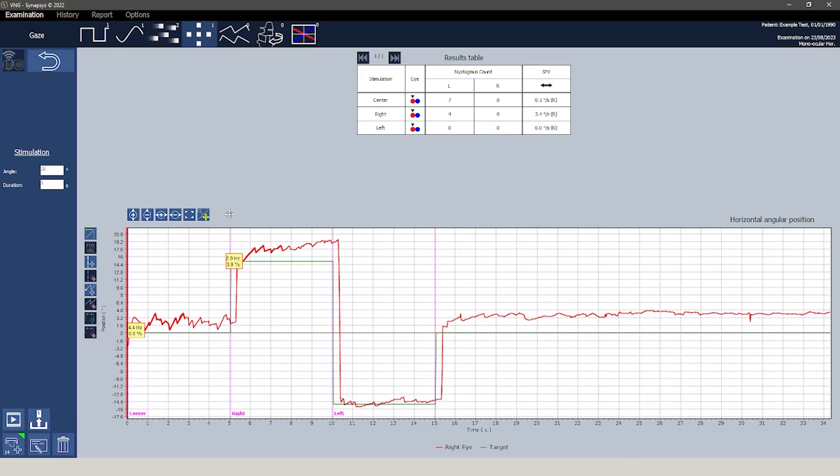On the upper section, a comprehensive results table is presented which organizes the findings based on analyzed position and gaze. This table includes information such as the number of instances of nystagmus detected and the slow phase velocity.